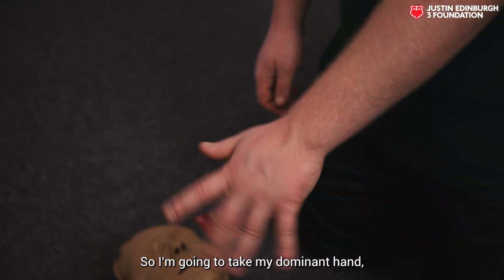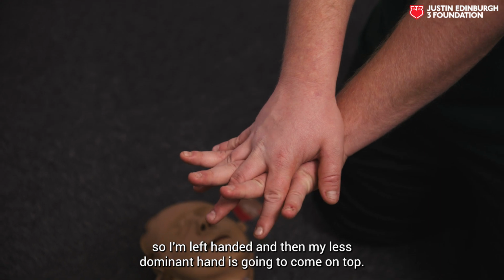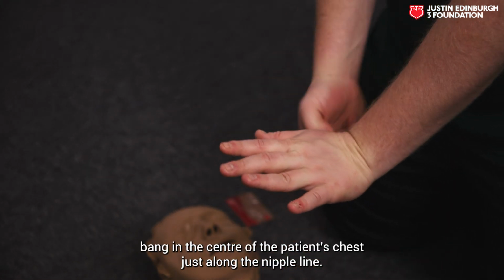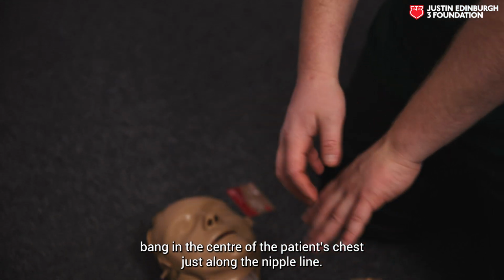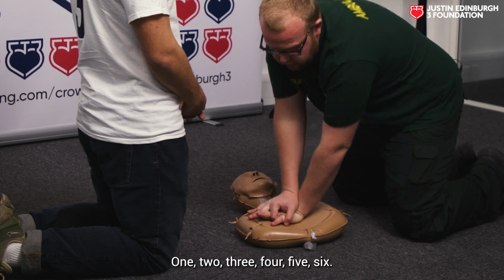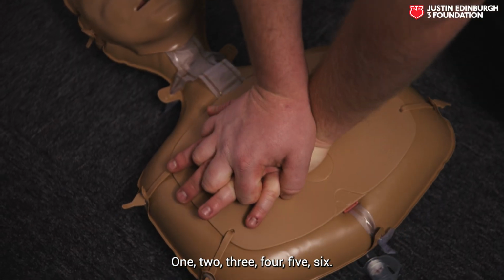So I'm going to take my dominant hand, so I'm left-handed, then my left dominant hand is going to come on top. I'm going to interlace my fingers and place the heel of my hand bang in the centre of the patient's chest, just along the nipple line. You're going to push hard and fast, twice a second. 3, 4, 5, 6.